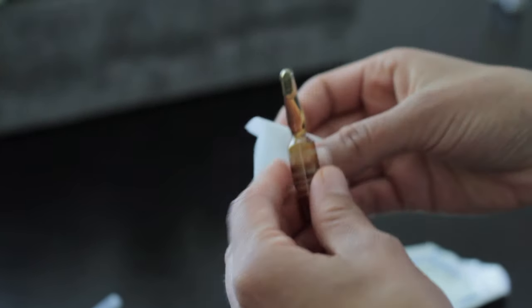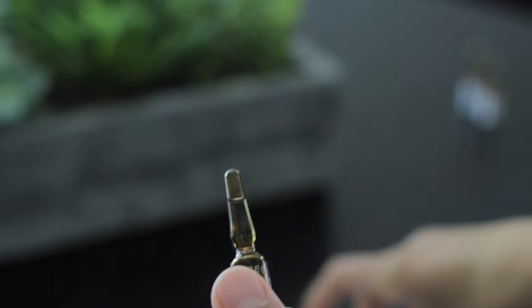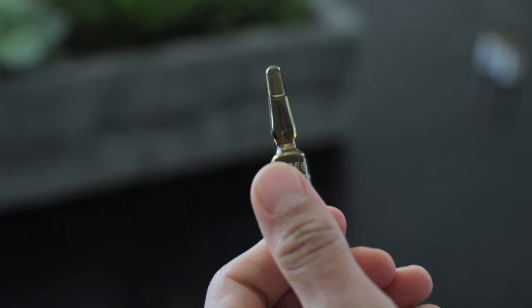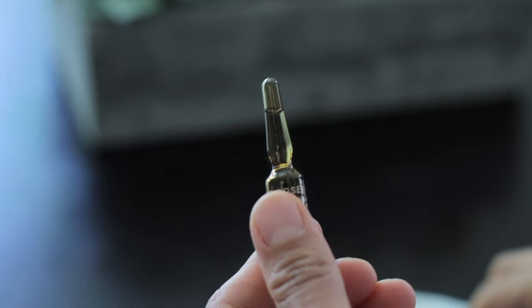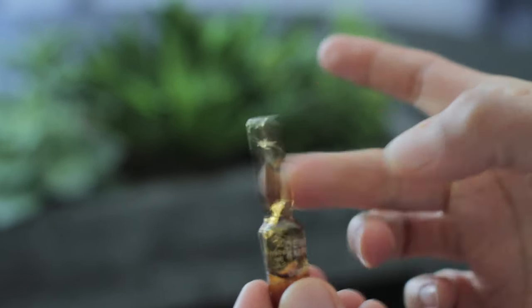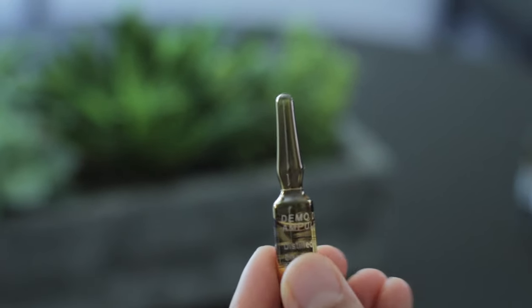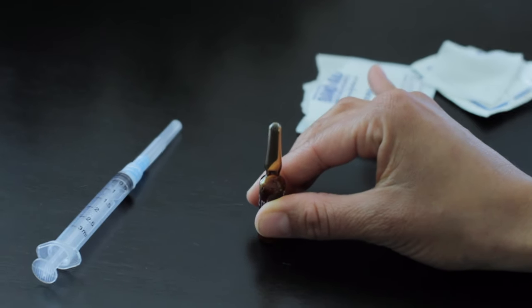All right, so grab that alcohol prep. You're going to clean the neck. Make sure you clean it for 30 seconds and allow it to dry. So while that's drying, I also want you to take a look at the medication here on the tip. We're going to have to flick that. So if you flick it with your finger, you'll notice it drops to the bottom and collects in the body of the ampule.